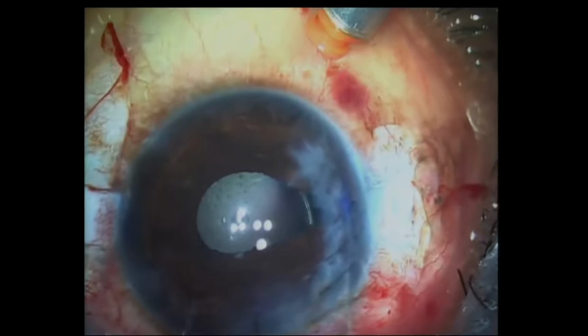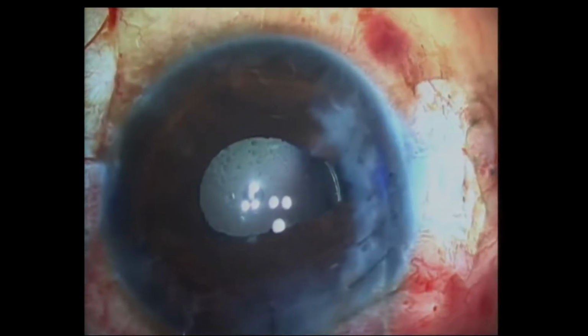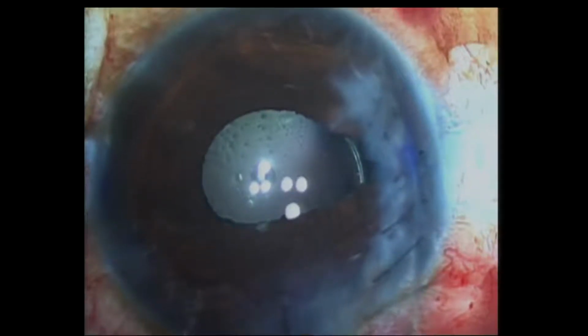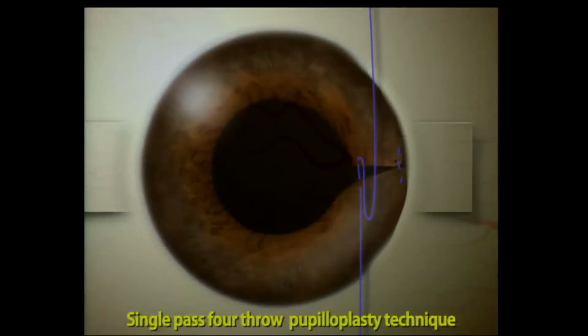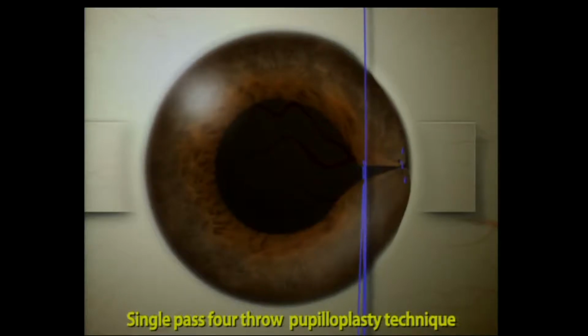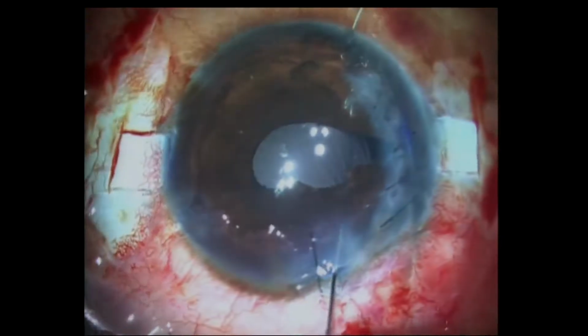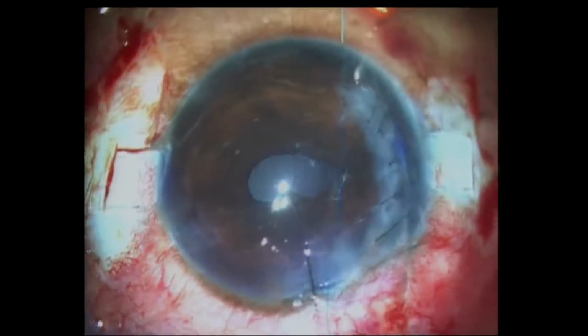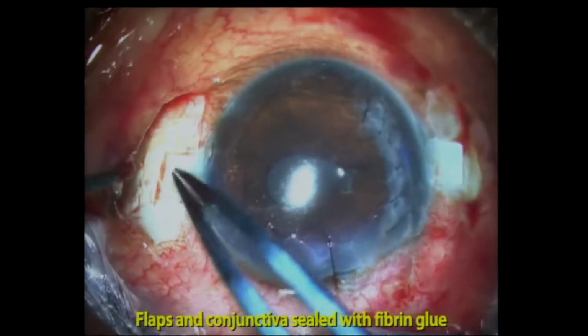Once you have this, I still have this nagging optic which is showing up over here, and I don't like to leave a patient like this. So now you can do the leaflets. If you had taken care of the pupillary zone first, you wouldn't have these leaflets to take care of later. So you actually have to go with the root first, then treat the iridodialysis, and the last would be the pupillary zone.